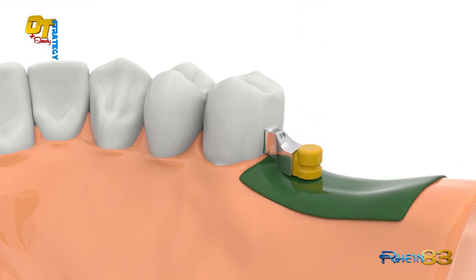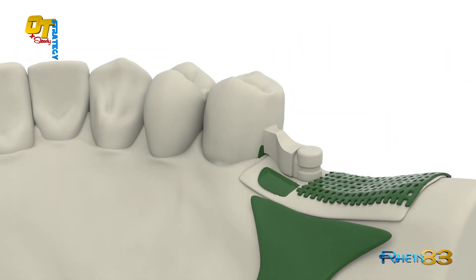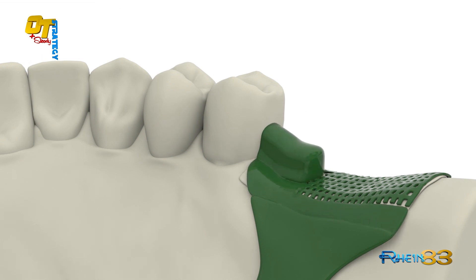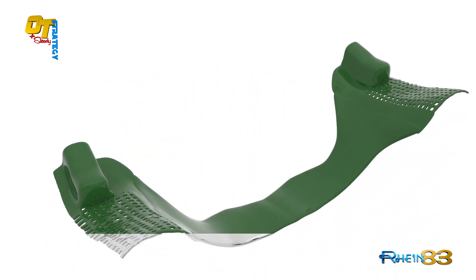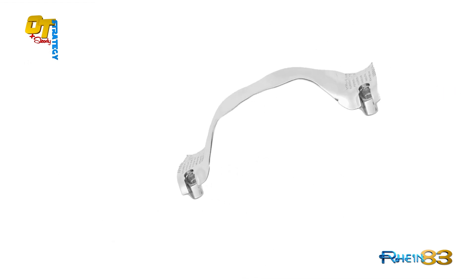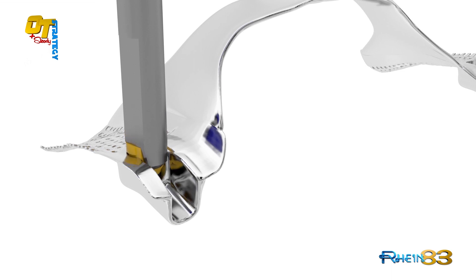Insert the yellow retentive OT strategy cap over the cast sphere and prepare the model for duplication. Pay close attention to duplicate carefully the steady so as to give the maximum precision and stability to the removable framework wax-up. Insert the retentive OT strategy cap into the frame housing and finish the removable framework.